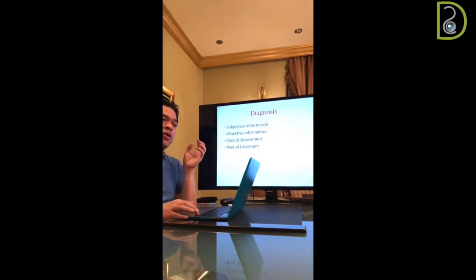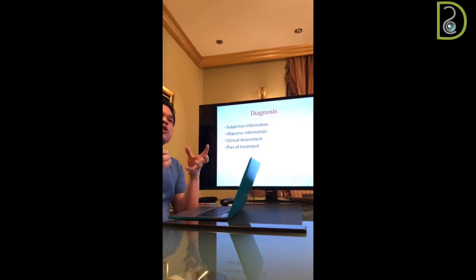If we go through the components of diagnosis, we have four more components. I will try to discuss the most important issues in this live stream because time is very short. We have subjective information given by patients, and objective information, which is what you find when you are doing the examination, either by radiograph or clinically.